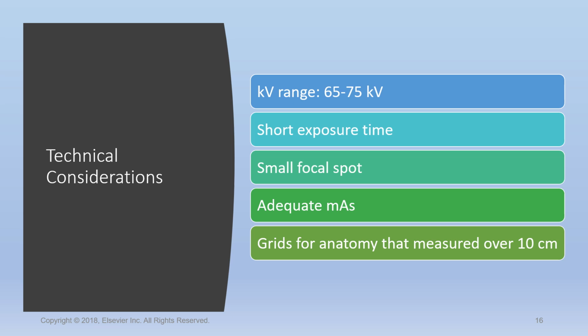We do have, just to point out, we looked at it before, but on 225, we do have the cast conversion chart. And remember, with that, we're looking at a small to medium plaster cast. You're going to increase about 5 to 7 kVp. A large plaster cast is 8 to 10, and fiberglass is typically 3 to 4. Okay. I recognize the exposure factors when they're talking on 224. They tell you that kVp is between 50 and 85, but I would tell you honestly, with digital, I don't know of anywhere that would use less than 60, honestly, unless it was a pediatric patient.